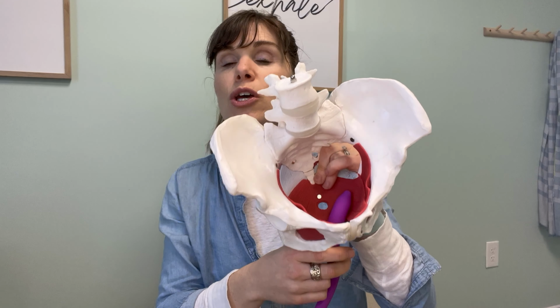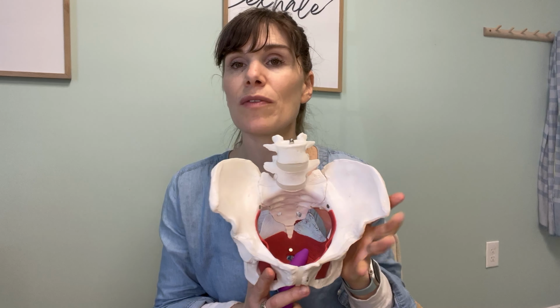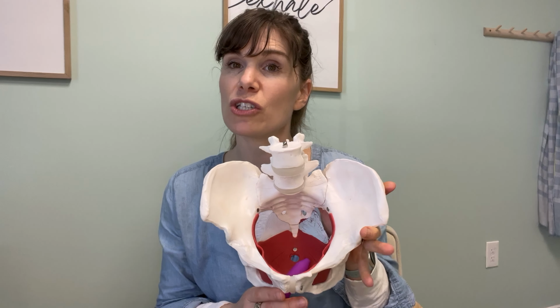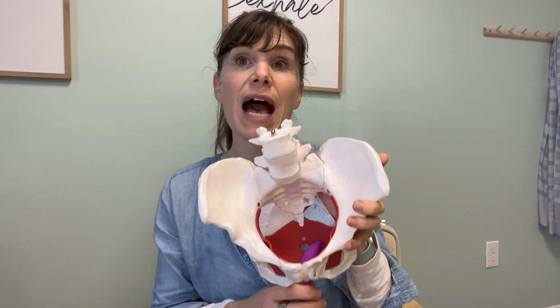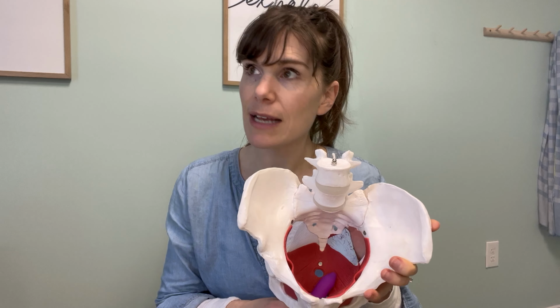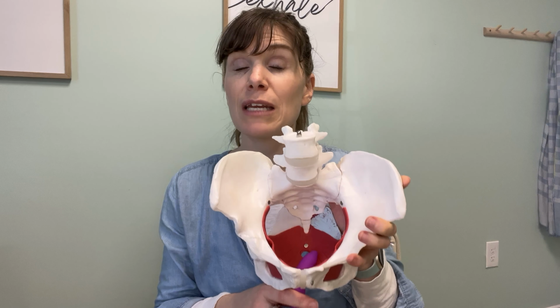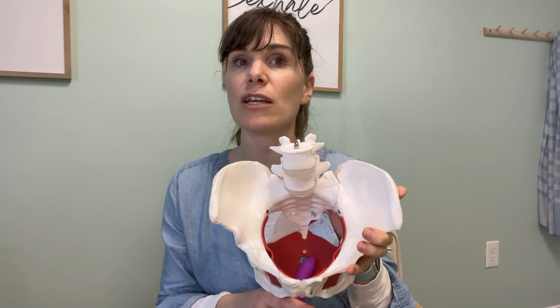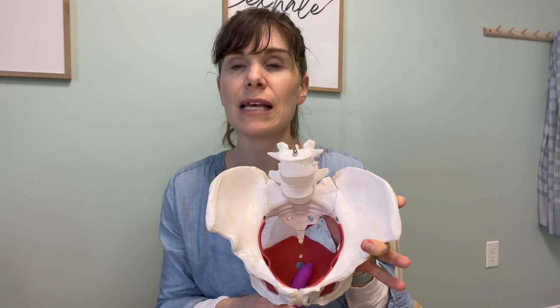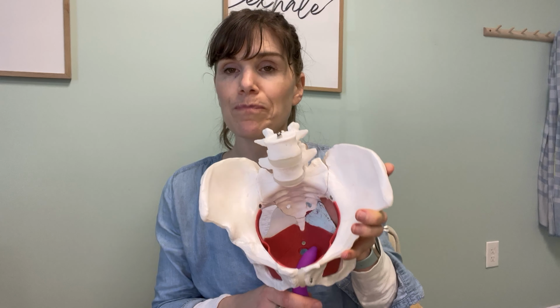You pause, you breathe, you put a gentle amount of pressure. You don't want to elicit anything more than a 3 out of 10 pain when you are doing this. So if you find the spot, ouch, that really, really hurts, oh my gosh, that's what I feel during sex, then you back off so that your body doesn't respond by guarding and tensing up. Your body goes, okay, I can handle this. And then what you're doing is you're resetting that response.